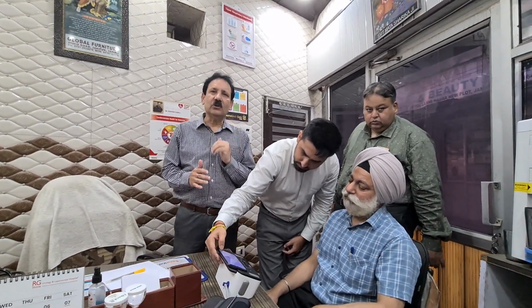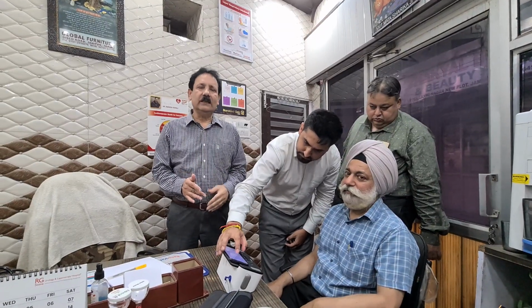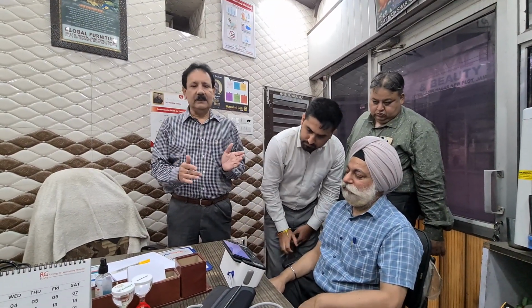In the continuation of this series, today we are conducting a free ECG camp in the clinic. Dr. Arora is right now having his ECG done. ECG is a non-invasive, painless investigation which records electrical activity of the heart. Now, this investigation is the first investigation which you advise to any patient who is having a sudden chest pain, palpitations, dizziness and shortness of breath.